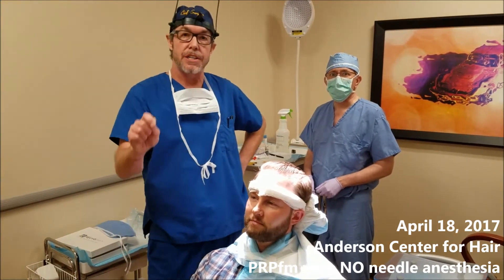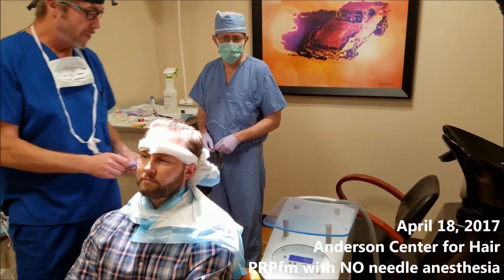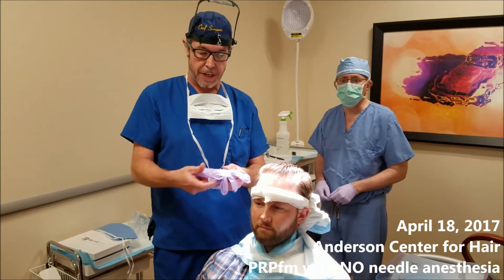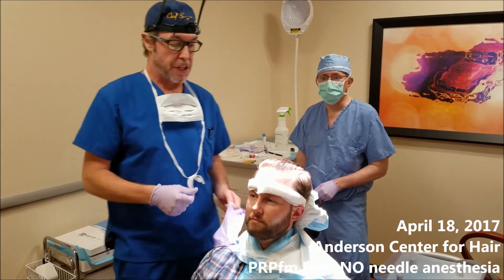Today we're going to change up the script a bit and we're using the Zimmer cooling system, which is pictured right here. It offers air loaded at minus 20 degrees Celsius and we're going to freeze the area right before we do the injection so that Todd, our patient Todd, doesn't have to go through the discomfort of the injections.